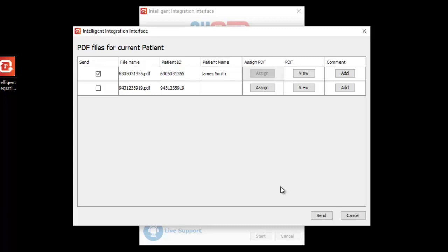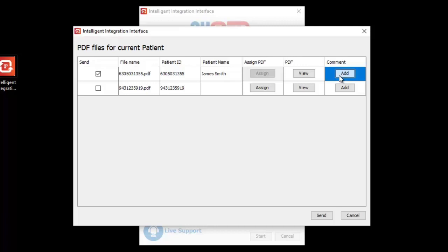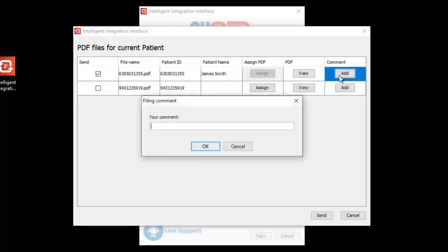Any ECGs intended for the confirmed patient will now be ticked to send. On the right-hand side of the screen, you can view an ECG by clicking the View button. As part of the filing process, you have the opportunity to enter a comment to be filed alongside the ECG report in System 1. For example, you might want to note any patient-specific symptoms or who requested the ECG. You can do this by clicking the Add button next to the ECG and typing the comment. Click OK to save the comment.